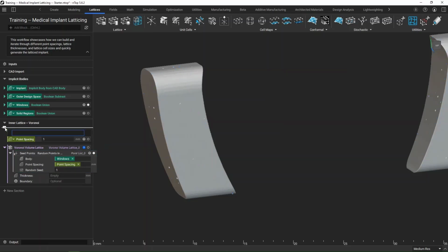So maybe we want to add in a little bit of information here. I can say that this is going to be the approximate pore size of the volume lattice. Actually, in this case, it's going to be the Voronoi lattice. There we go. All right, what next?